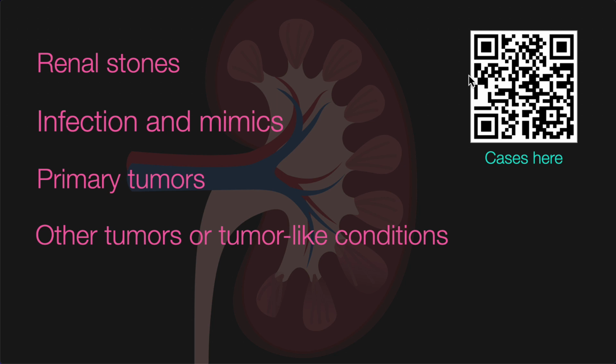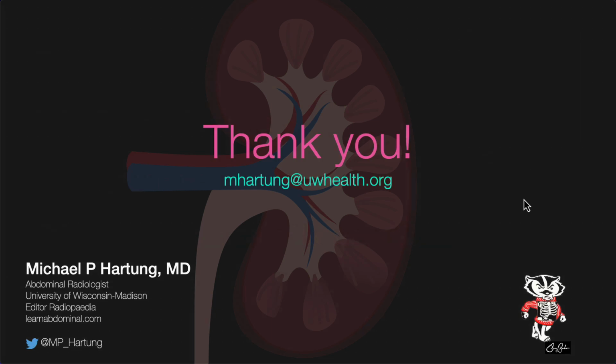All right, so we have covered a lot of ground, including renal stones, infection and mimics, primary tumors, and other tumor or tumor-like conditions. Many of these cases are available here in DICOM format for you to review on my website. And I thank you very much for your attention, and I hope that you found this talk helpful.